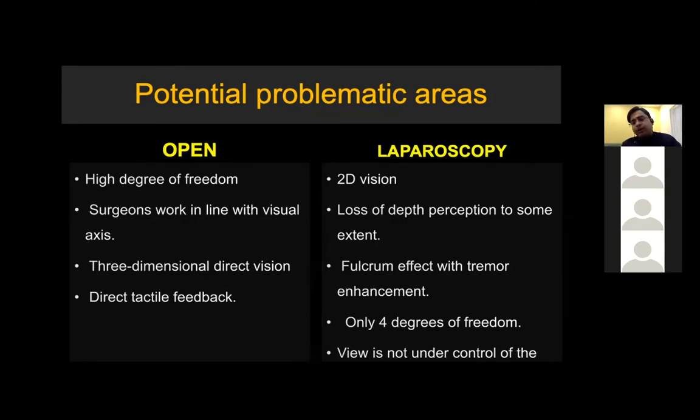Second important issue with laparoscopic urology or laparoscopy in general is that all instruments behave like a lever. Means they move around the fulcrum. So if you move your handle down, the tip inside the abdominal cavity moves up, and if you move your handle right, the tip moves left. So this counterintuitive sense and the lever phenomenon of each instrument make the procedure difficult.